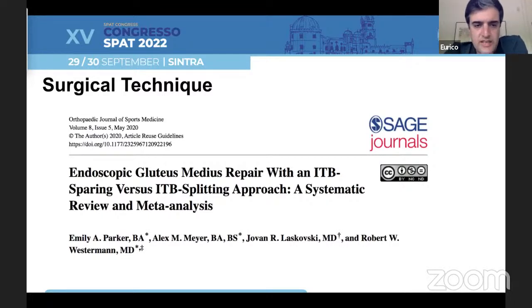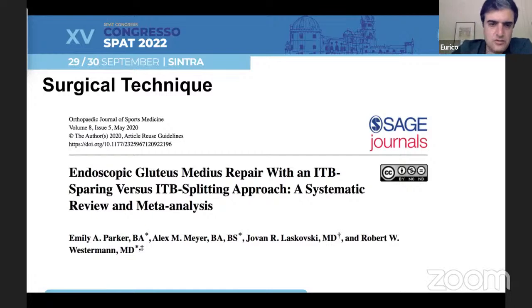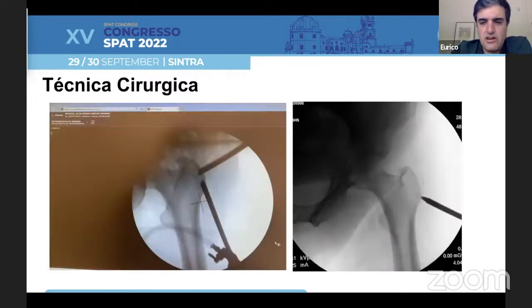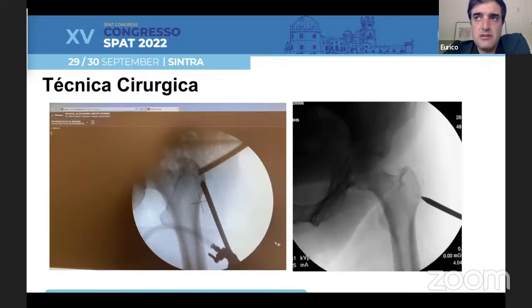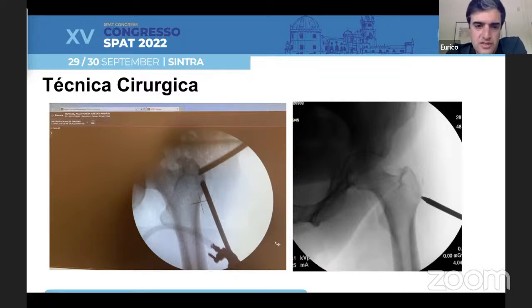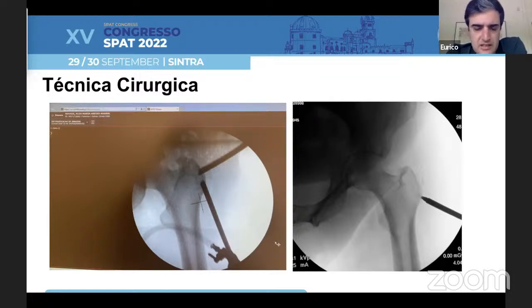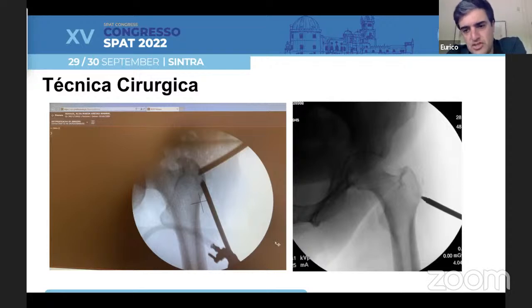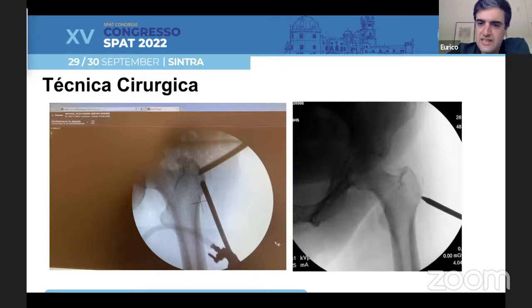I use an ITB-sparing approach versus an ITB-splitting approach, but what we tend to find is that there are no major differences between the two. I find that if you use an ITB-splitting approach, probably on your first cases it will be much easier to enter that space. I use a 30-degree scope, just like in the shoulder, and I triangulate always using fluoroscopy to check for the right position and angle for placing my anchors.